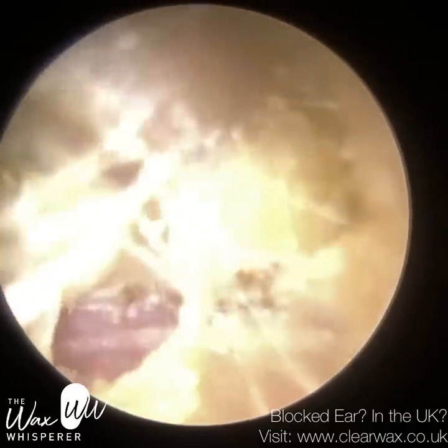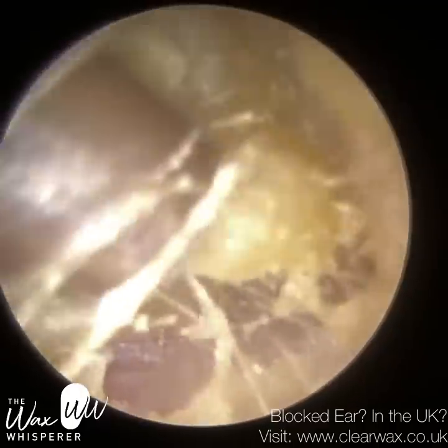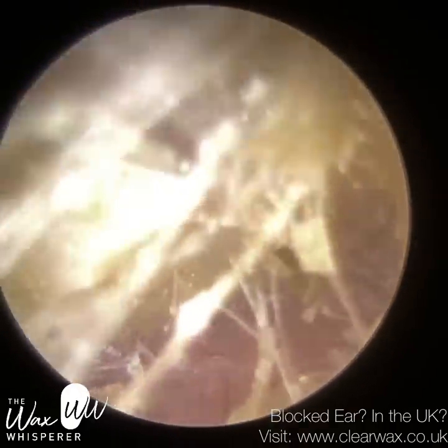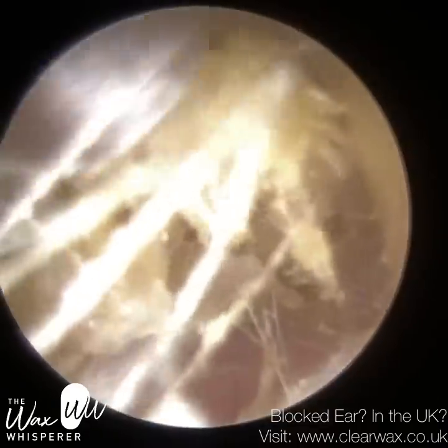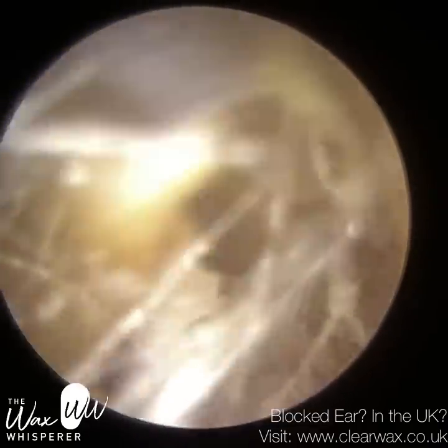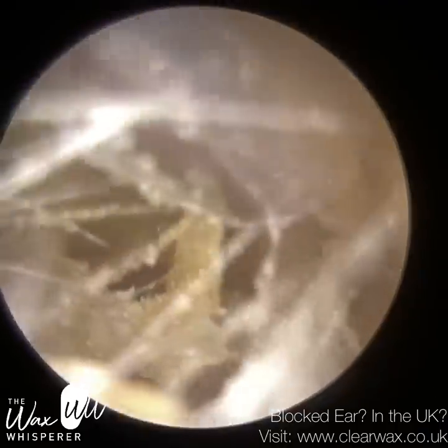I'm just commencing with microsuction and I'm trying to detach this very sticky and soft, mushy, glutinous wax and keratin off the canal wall.